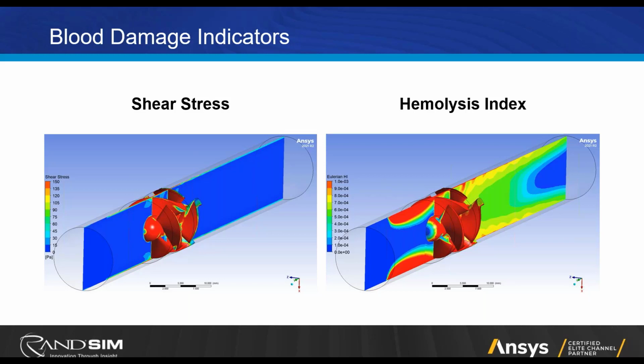Remember the pre-swirl upstream that we saw in that streamline plot. You can see the impact that has in the hemolysis model, because although the shear stress is not extremely high, the flow is swirling and getting stuck in that area for a while, so its exposure time to these relatively high values of shear stress is what's captured here, which you would miss if you're just looking at shear stress. And you can see also downstream of the device, the wake effect and the swirling that occurs there. Even though it's less severe than upstream, it's still significant enough that hemolysis is a potential issue.